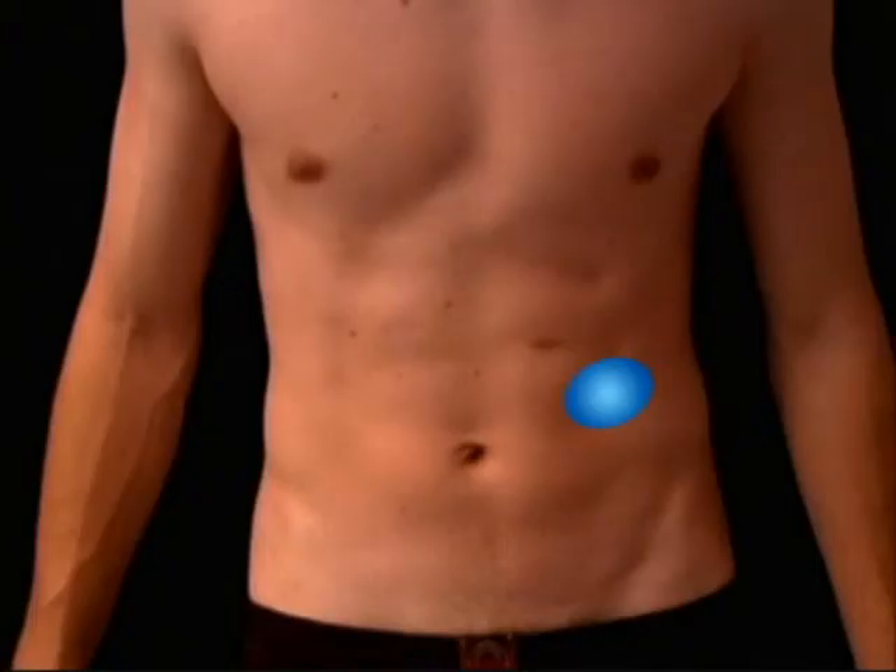Remora is a continuous glucose monitoring system comprised of a tiny glucose sensor and Bluetooth transmitter that wirelessly communicates with the Apple iPhone. The sensor and transmitter are housed in a silicone rubber unit that is worn on the abdomen, similar to available continuous blood glucose monitors.